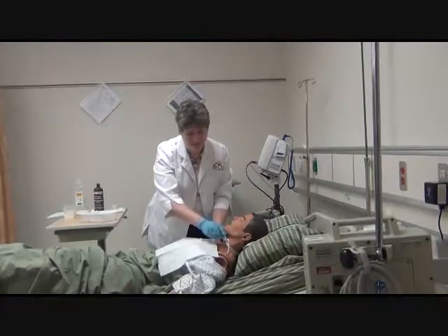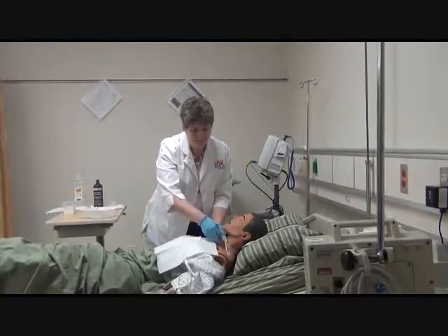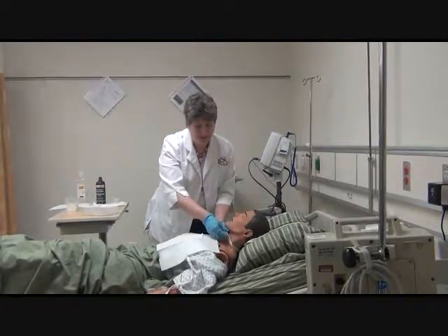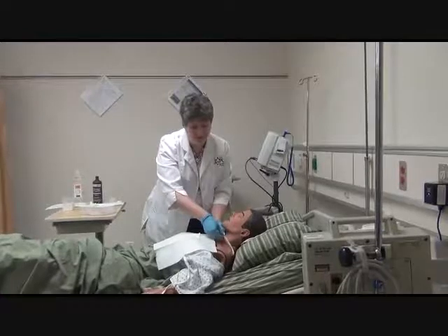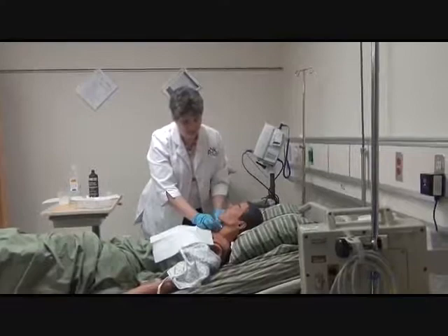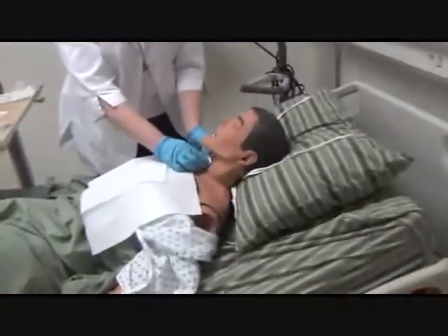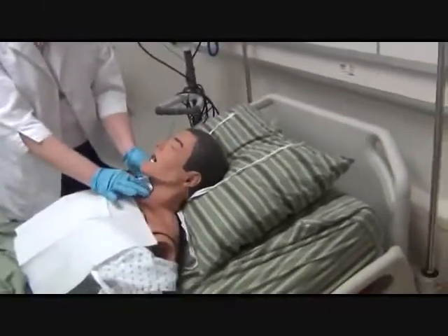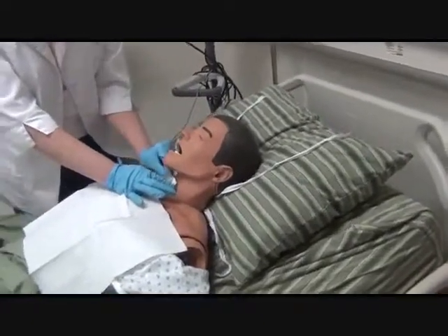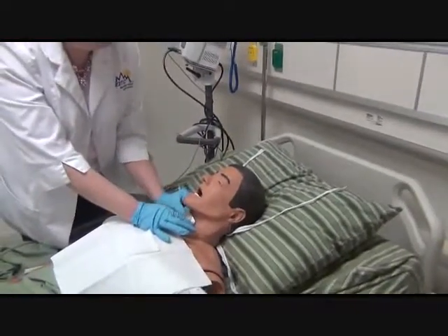This again, the tweezers come in really handy for helping. These ties can be really slimy because of the mucus discharge and the secretions from the wounds. Make sure that you don't put your thumb over their airway hole or block that. And again, you want to maintain security. If you notice, I don't put my fingers behind the trach plate because I would not want to accidentally make that come out.